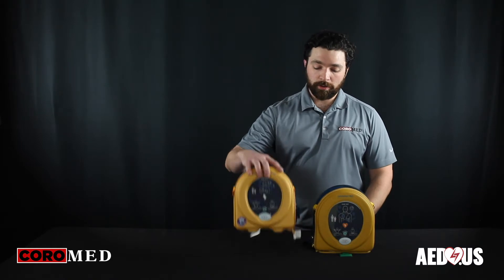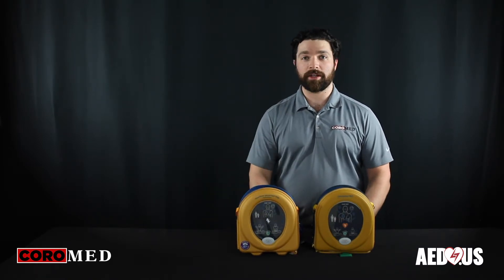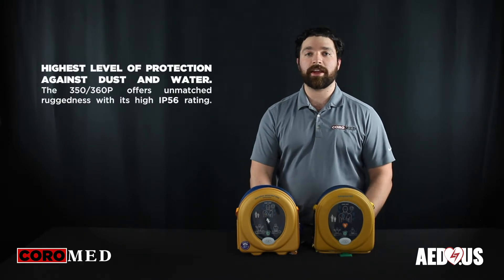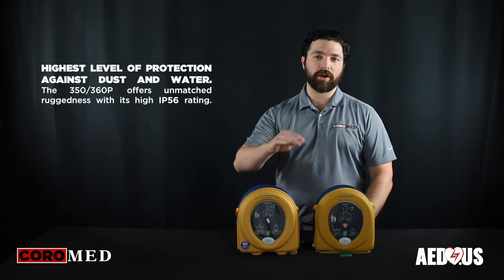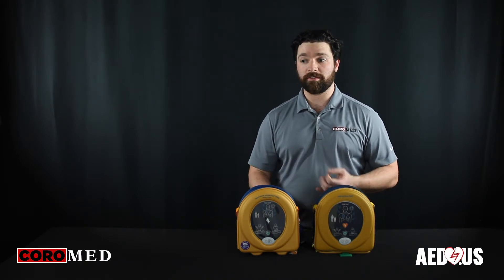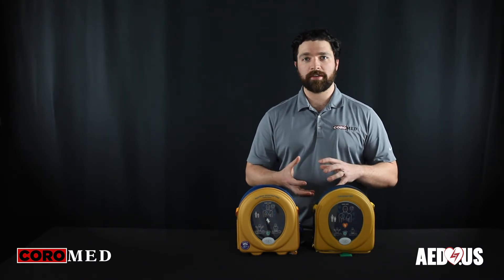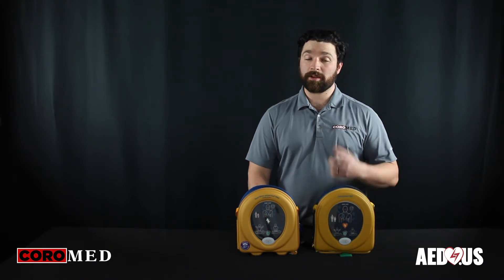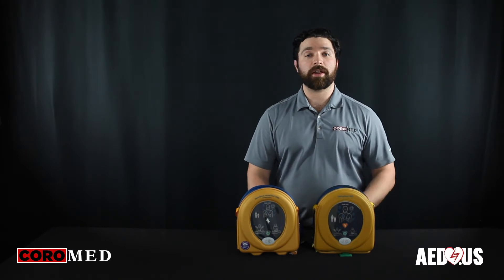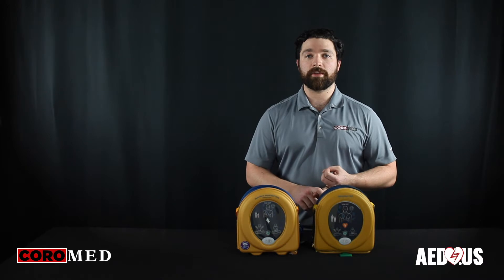At only 2.4 pounds, these are some of the lightest devices on the market, and with a high IP dust and moisture rating, they're absolutely perfect for outdoor situations such as concerts, athletic events, and festivals. Also, with their lightweight and small size, they're easy to travel with, making them ideal for athletic trainers who have size and weight requirements to work with.